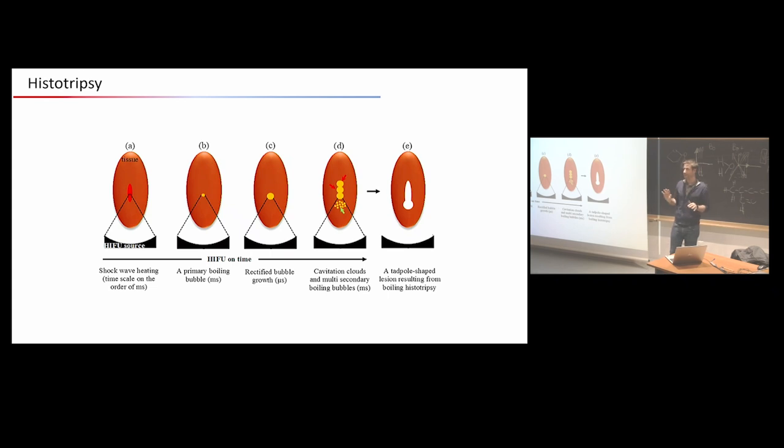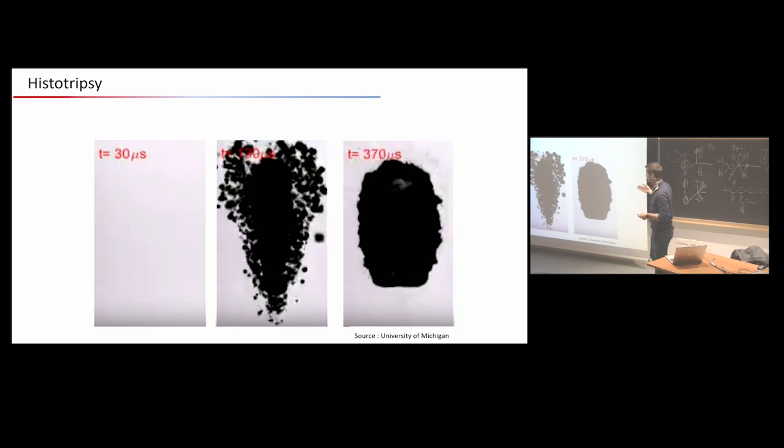This is typically used for, I don't know, if you have a ring like me, if you go to the jewelry, you say, okay, I'm going to clean your jewelry. It's going into ultrasound baths. Maybe some of you have some ultrasound baths in your labs just to clean instrument. This is histotripsy, in fact. It's washing everything. So that's what we are doing in your body.